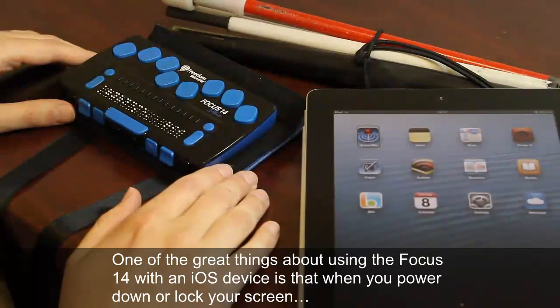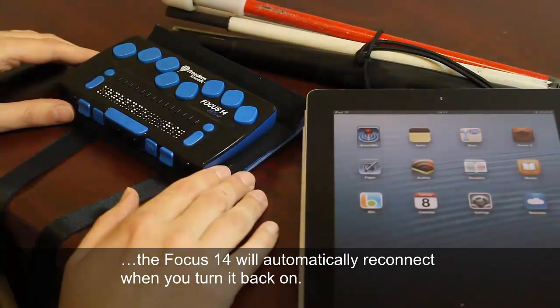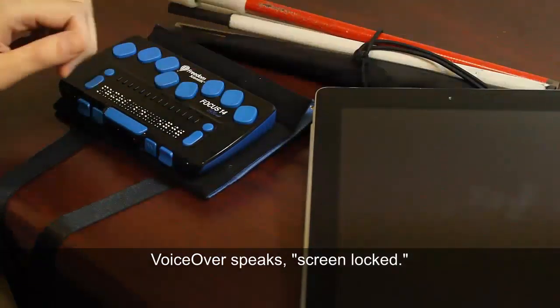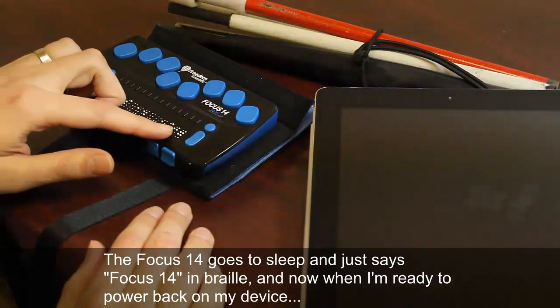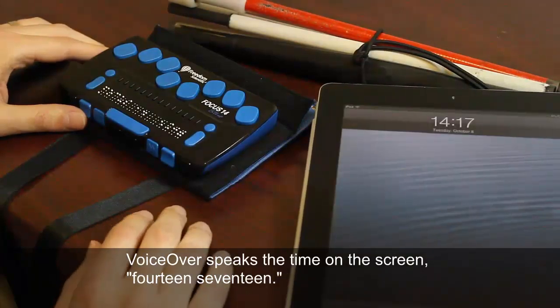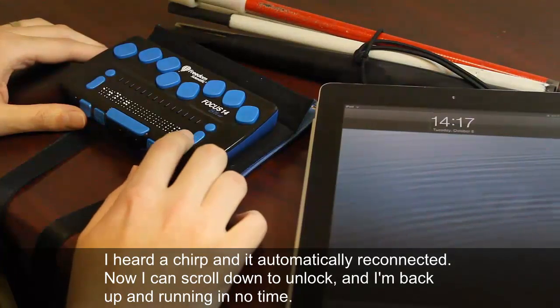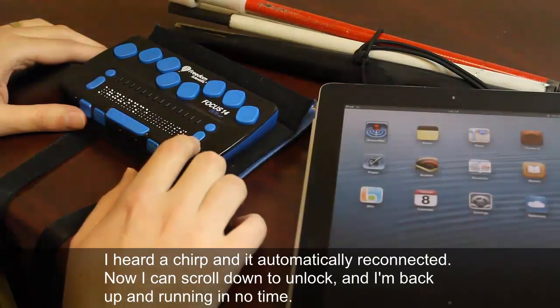One of the great things about using the Focus 14 with an iOS device is that when you power down or lock your screen, the Focus 14 will automatically reconnect when you turn it back on. I'm going to lock my screen — the Focus 14 goes to sleep and just says 'Focus 14' in Braille. When I'm ready to power back on my device, it automatically reconnected, and I can scroll to unlock. I'm back up and running in no time.